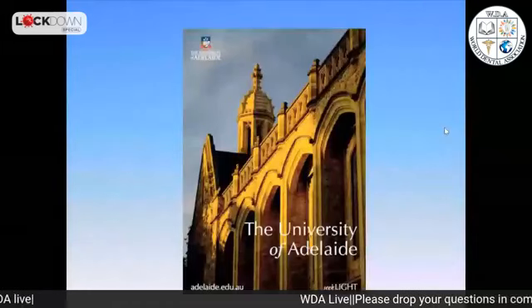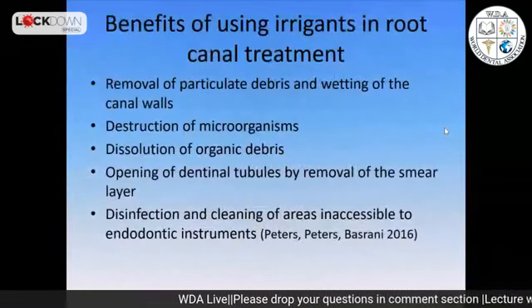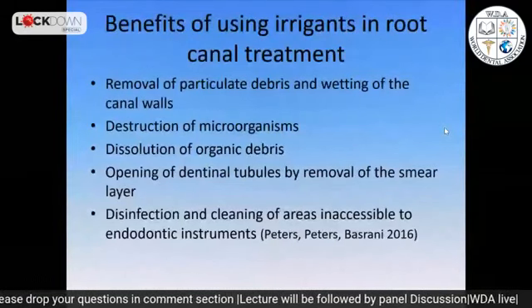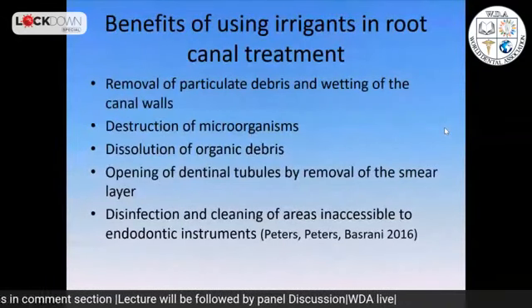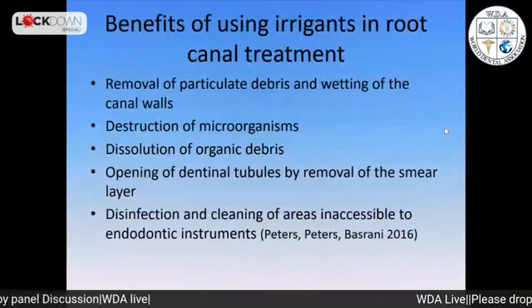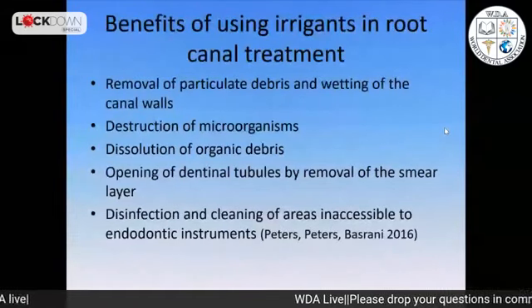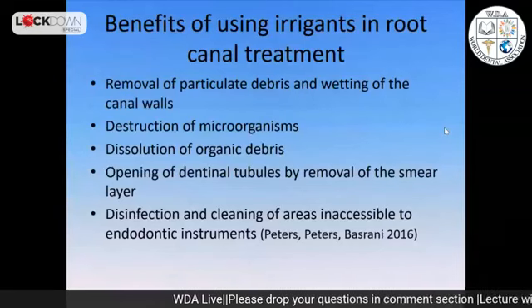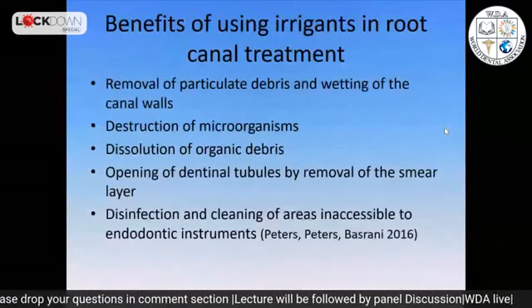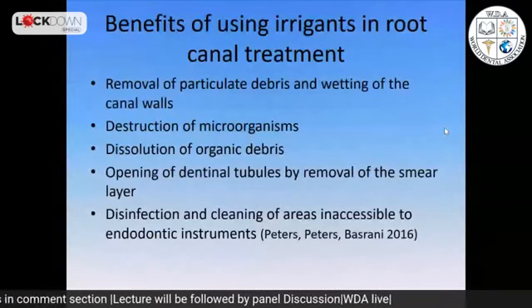Now, why do we need to do this irrigation? We always need to ask why we do things, and there are some goals, some objectives. So we need to remove debris and wet the canal wall, and this is actually one of the most important factors that we tend to forget. We need to kill microorganisms in infected root canal spaces.